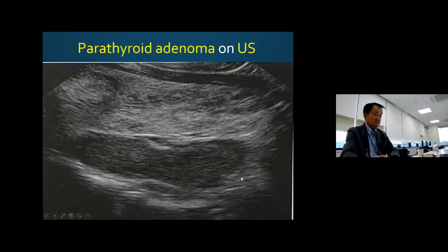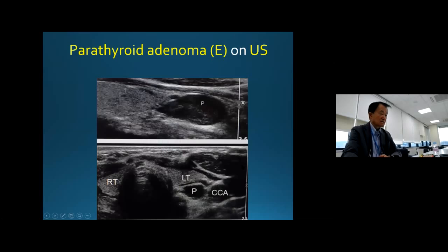Yeah, see, just hypoechoic. So ultrasound always, depending on personal experience, it's thyroid here, uniform echogenicity of tissue, some adenoma or things is hypoechoic.